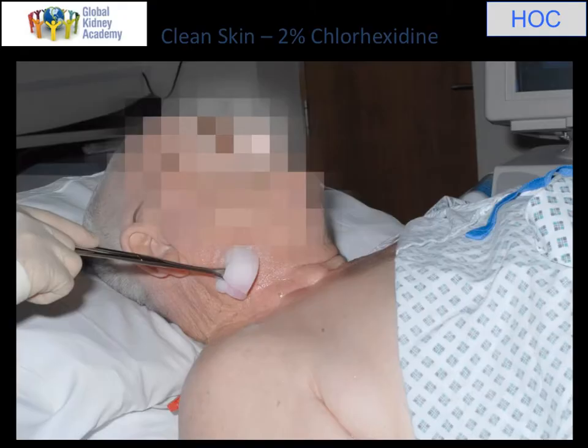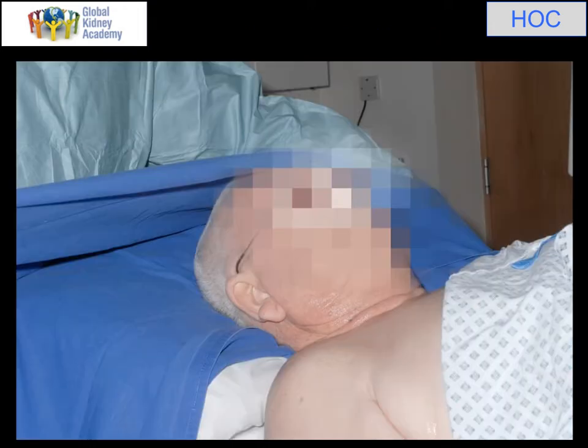These are a series of still shots rather than a video. As we join now, I've already pre-scanned the patient's neck with an ultrasound machine, wiped away the jelly, cleaned once with 2% chlorhexidine, and I've now got a gown and gloves on. I've got a pot of chlorhexidine on my trolley and I'm cleaning the patient's skin for a second time. Obviously the patient is wide awake — this is done under local anaesthetic. You can tell this is a few years ago because we were still using nice cotton sheets; nowadays it's all disposable sheets.